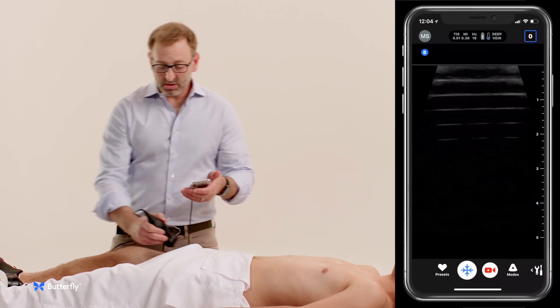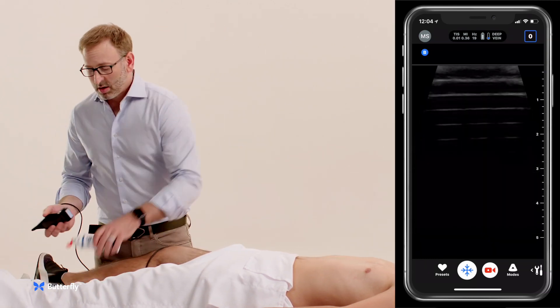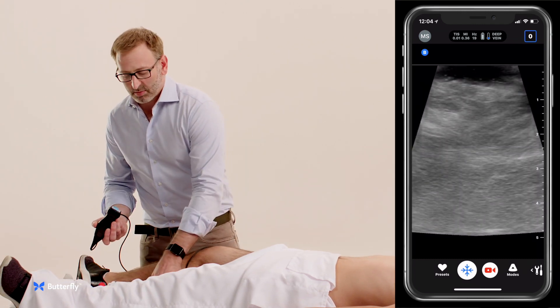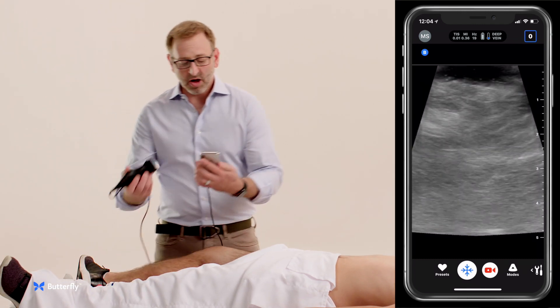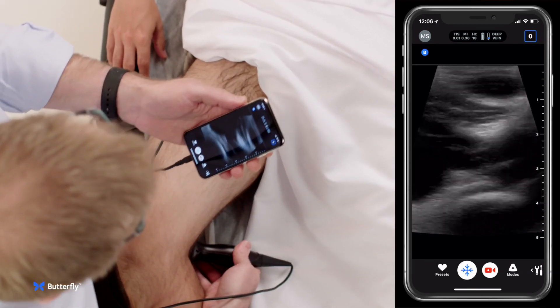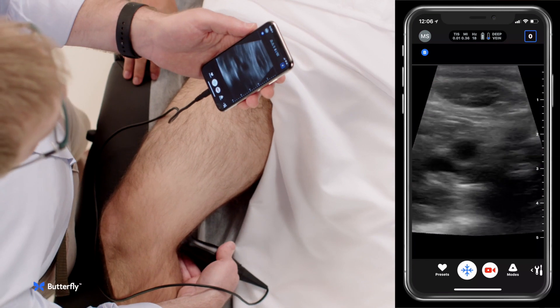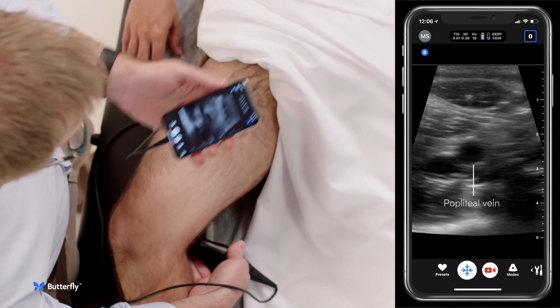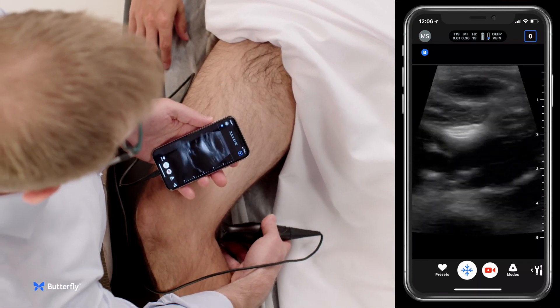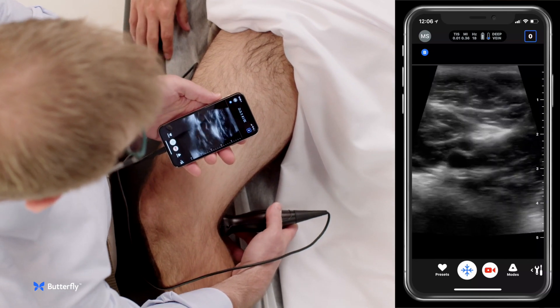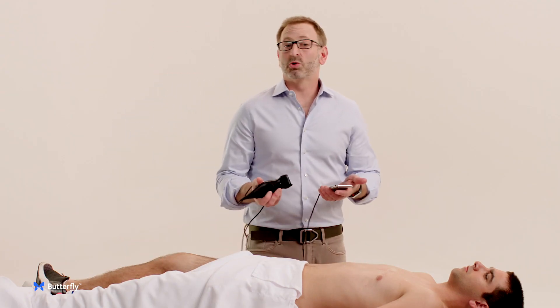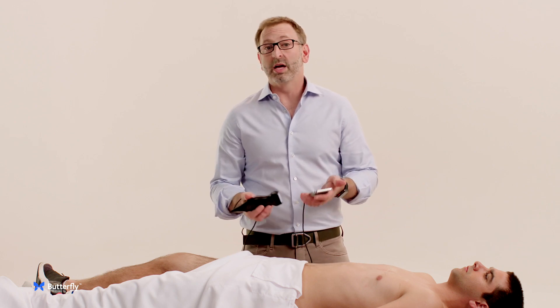I would typically follow all the way to the knee. In this case we'll abbreviate the exam and show the popliteal exam, which would follow the full course of the femoral vein. Using a posterior approach, we identify the popliteal vein, confirm it's compressible, and follow it down until it trifurcates. That's an evaluation of a patient with shortness of breath or dyspnea using the IQ.